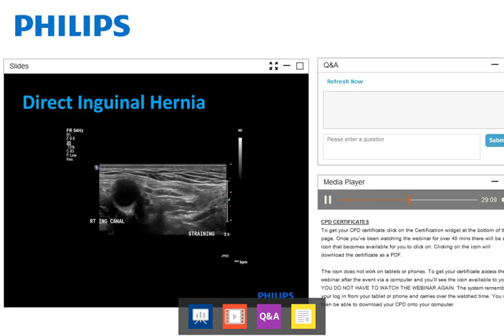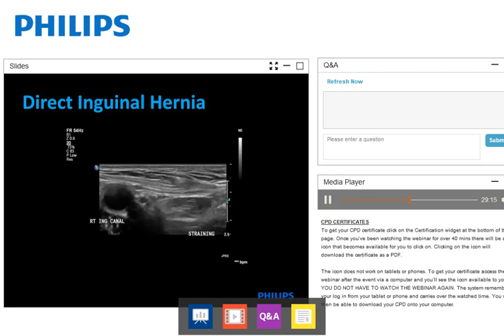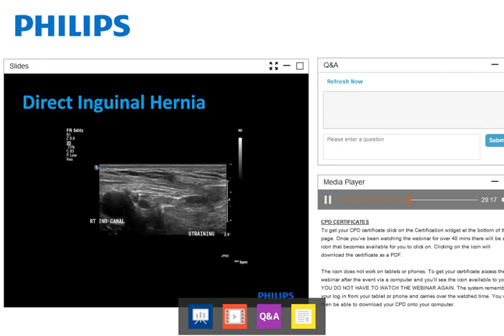Yes, there we are. So once again, we can see the fat coming, when it comes, yes, here it is, coming straight up towards the probe, turning over 90 degrees and going down to the right of the image. You can even see the origin of the inferior epigastric artery there on the left. So therefore we know we are medial to the origin of those vessels. There it is there.